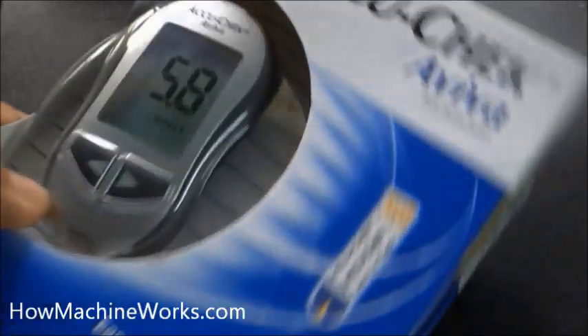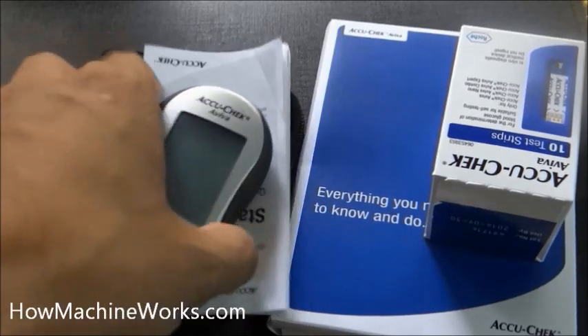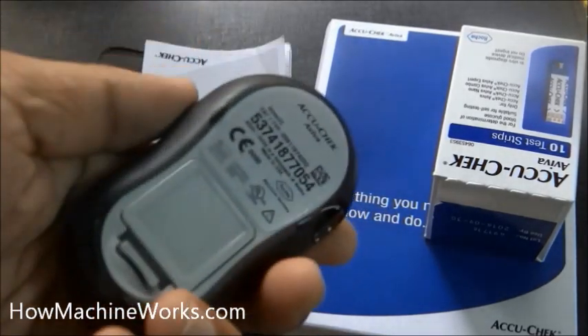Welcome back to HowMachineWorks.com. Today let's learn how to check your blood sugar level or glucose level using an active check meter. That's the unit we have — that's the meter, the active check meter.